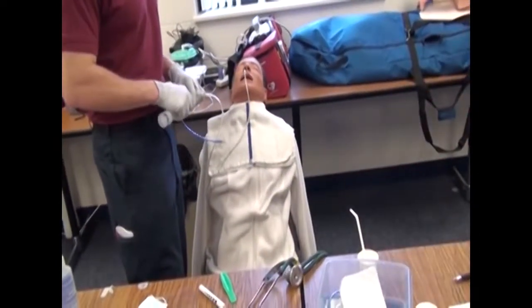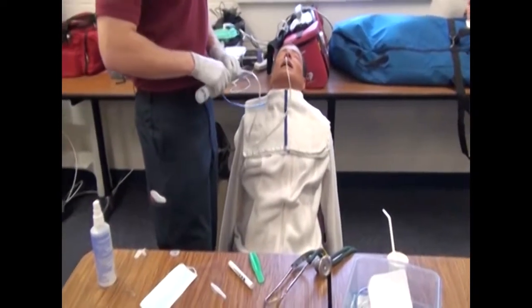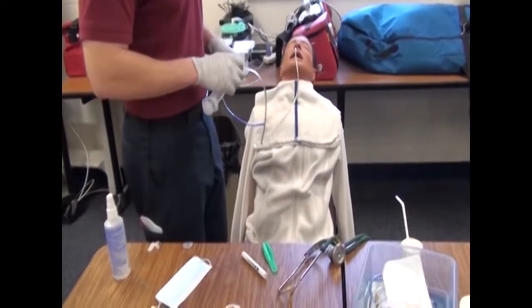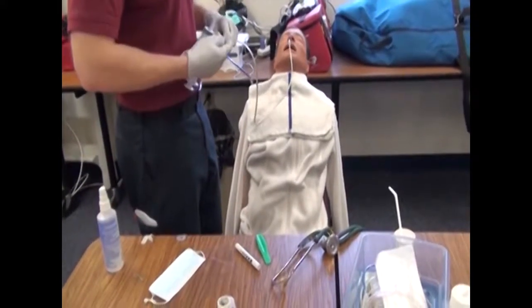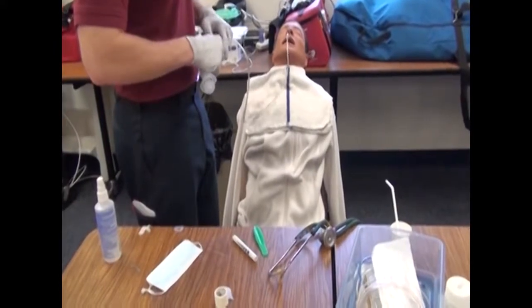Clamp end of tube or connect to suction. Okay, just take that connector, that spacer right there, that's on the table. Yeah. Stick it in the tube where that syringe is, and then hook that blue end up to it, and that's clamped. Tape NG tube to client's nose.